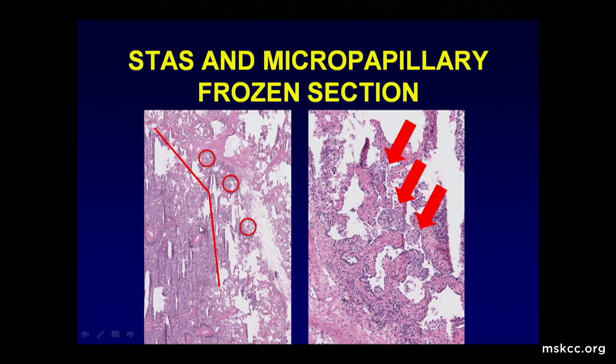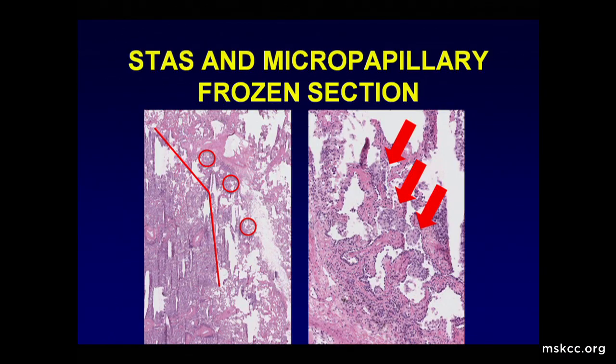So here's the edge of the tumor in this frozen section. And I hate to say this in front of the department, but our surgeons are starting to ask about this now at the time of frozen. And fortunately, in the two cases in the last month where I've been asked that, and I said it was there, they were making an intraoperative decision either to do a limited resection versus a lobectomy. When I said it was there, I was correct.